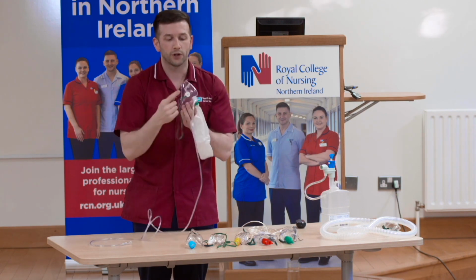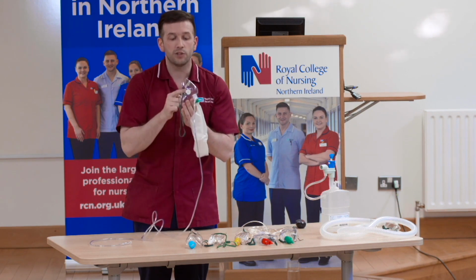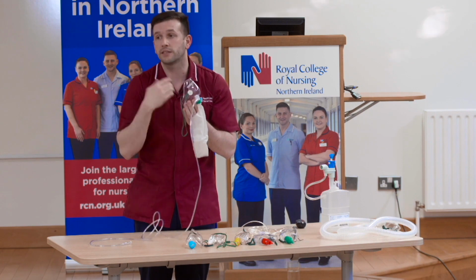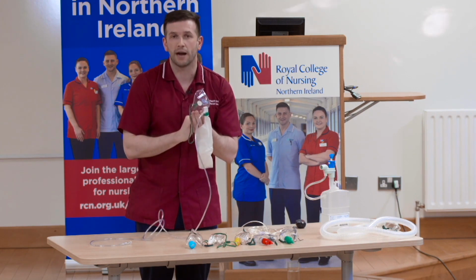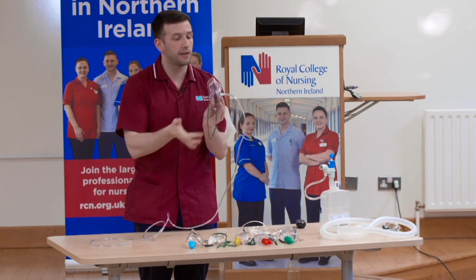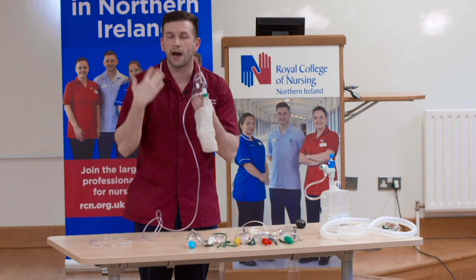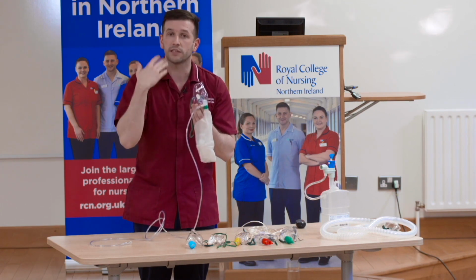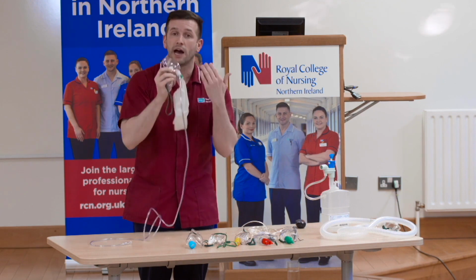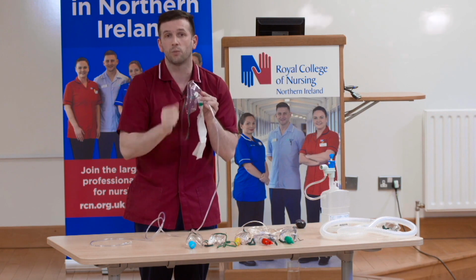As you look on this mask, you're going to see the one-way valve that we've just spoken about, and you're going to see another one-way valve on one side of the interface. These one-way valves prevent carbon dioxide rebreathing, hence the term non-rebreather mask. As the patient breathes in, this valve will open and they will breathe in as pure and high a concentration of oxygen as possible. As they breathe out, their expired gas occludes this valve, allowing the bag to refill, and their expired gas exits through the one-way valve.